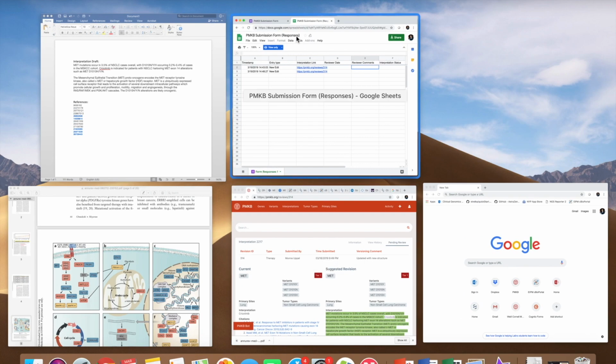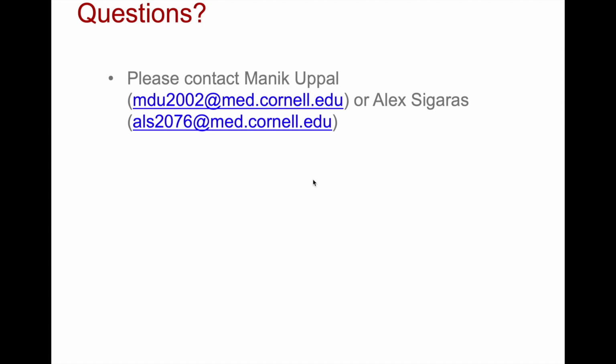Okay, so in this video, we've walked through how to find an interpretation to edit on PMKB, how to acquire the information necessary to draft an interpretation, and how to acquire the appropriate references. This video tutorial was meant to be illustrative of how to make use of other knowledge bases for acquiring the information relevant to the gene variants that we're writing about. I just want to emphasize, it won't be the same for every variant. For many variants, there may not be a targeted therapy, or the variant may actually confer resistance to therapy. Or the variant may simply have an association with overall survival, but without therapeutic significance.